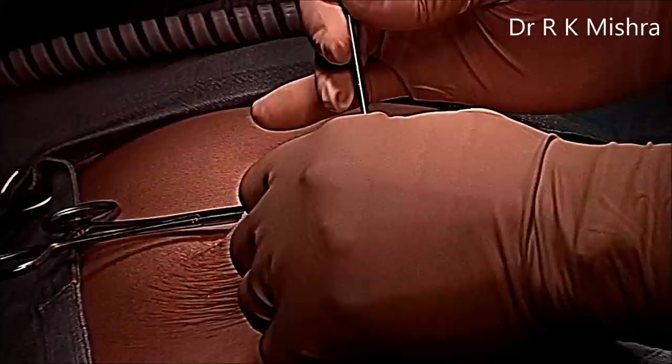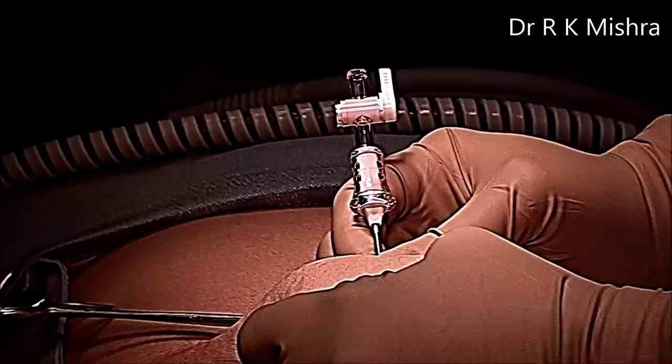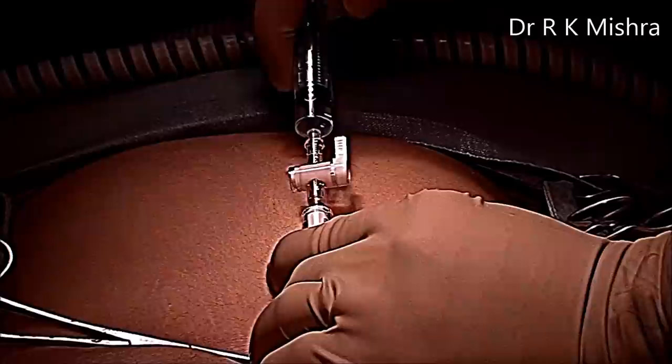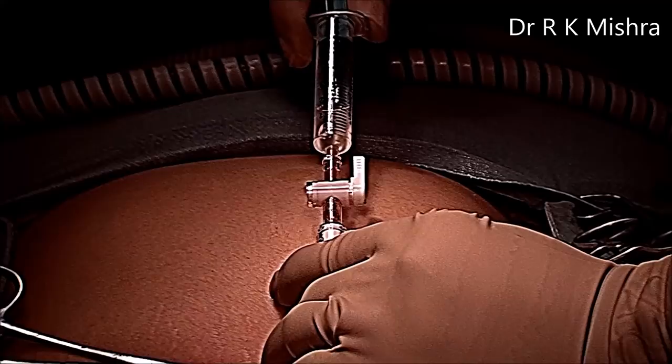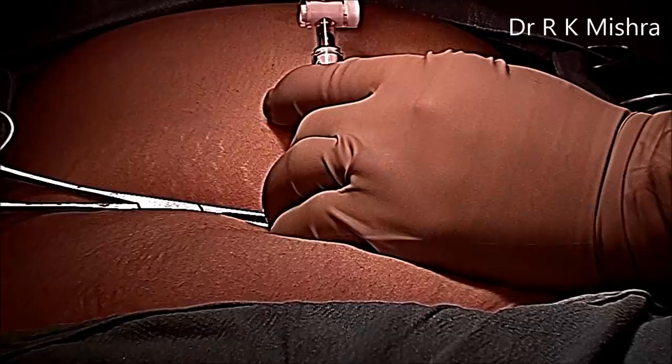Irrigation, suction, and hanging drop test were performed. In the suction, a little reddish fluid came out — that was due to blood collected into the pelvic cavity. Now we start insufflation.